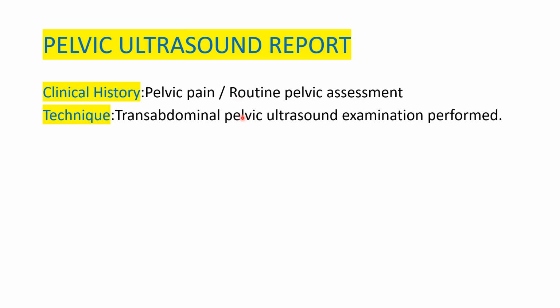So the fundamental thing is reporting or documenting what you see. This is the thing that most people overlook, but it is the biggest challenge that we have. People make misdiagnoses because of poor report writing skills, and they can miss certain areas or regions because they don't know what to report and what to look for when they are doing a pelvic or any other type of sonographic scan.